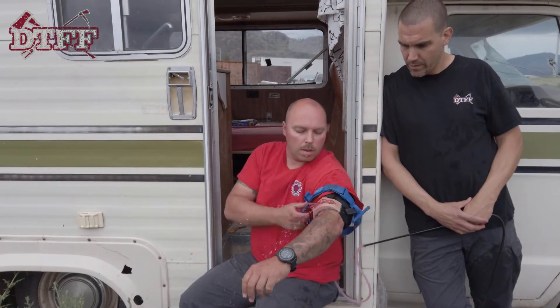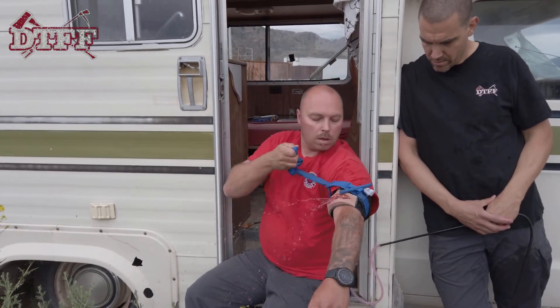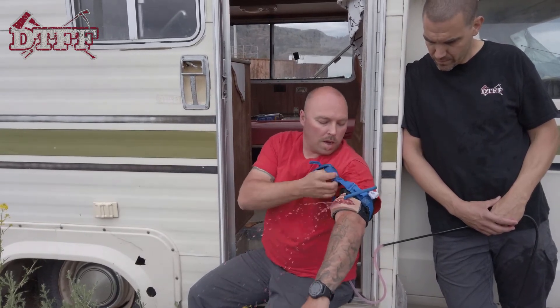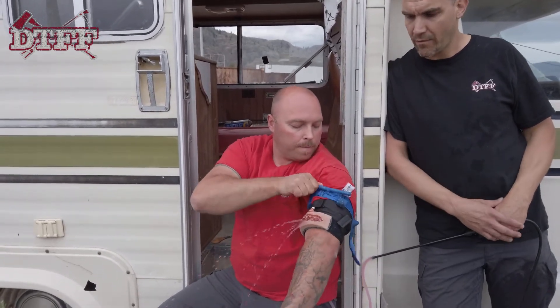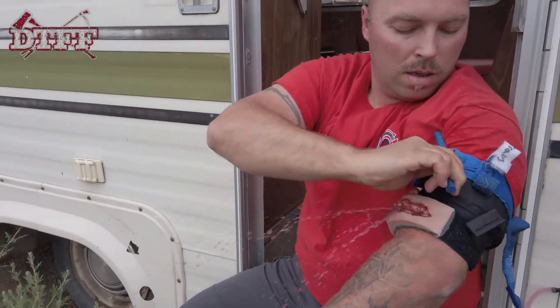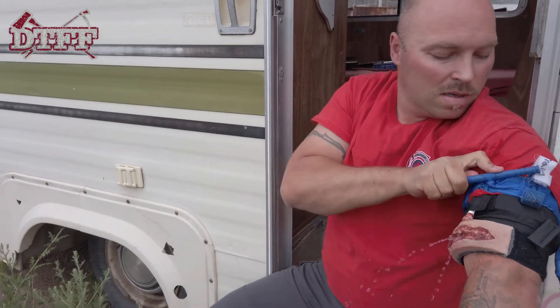It's got a good flow going. He's cinching it down — we want to go high and tight. It looks like a lot of blood, but we saw how much it really would be on the ground — maybe not even half a liter yet — so he's still got plenty of time. It is slippery, as you can tell.